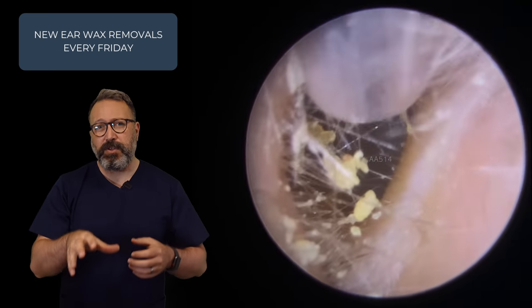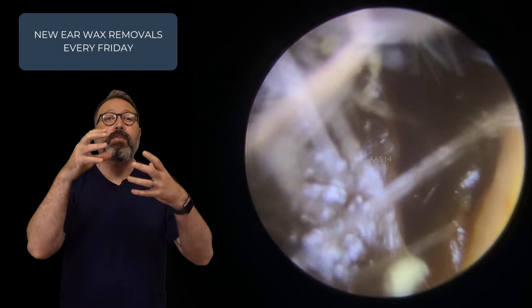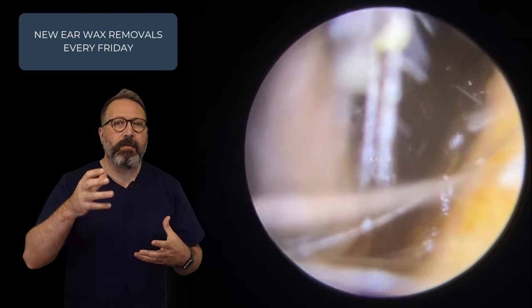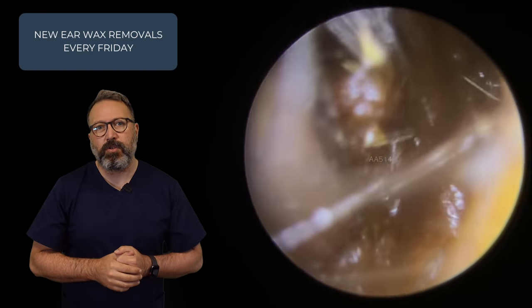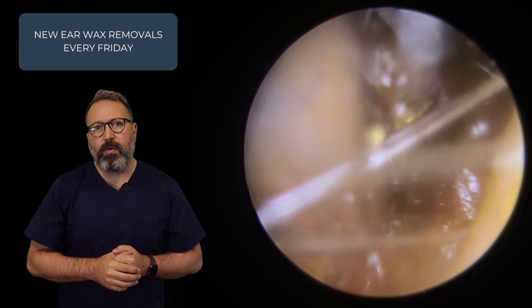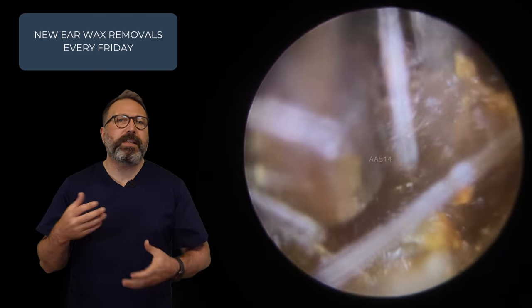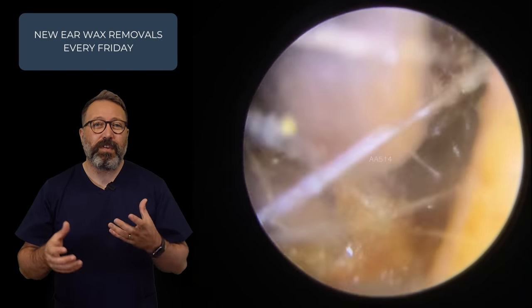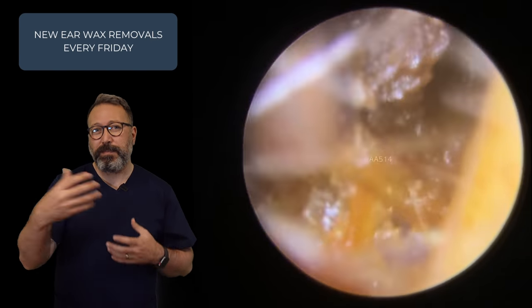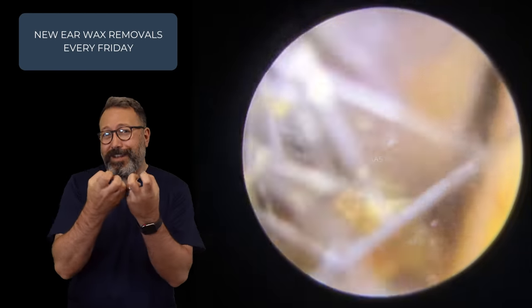Very humid ear canal, this one. You can see very dense cilia around the outside edge of the ear canal, and the wax itself is very, very dark in color. So we're just using the standard size Zoellner tube on this one. Also very, very sticky, this type — we're seeing a lot of people with stickier wax coming through at the moment. There's no particular reason for that; you just do find you go through phases of people coming through with a particular type of ear wax. You can see this one's holding on for dear life though.